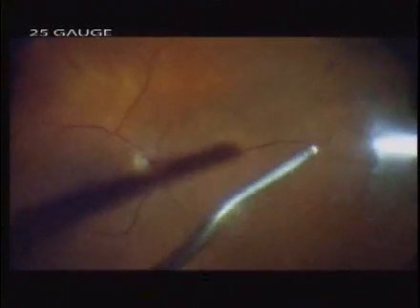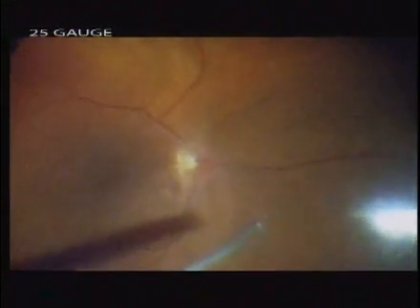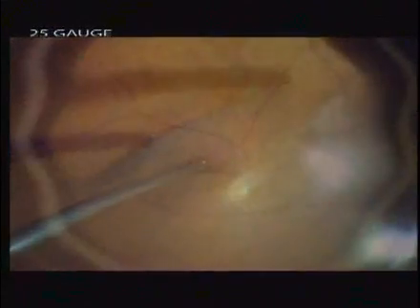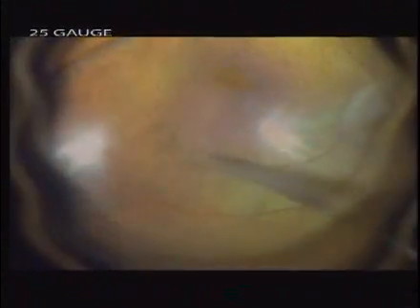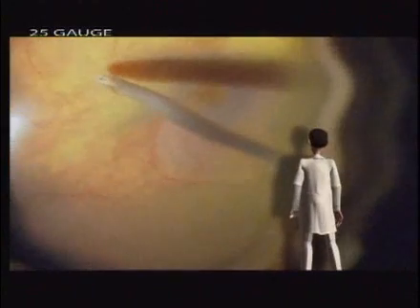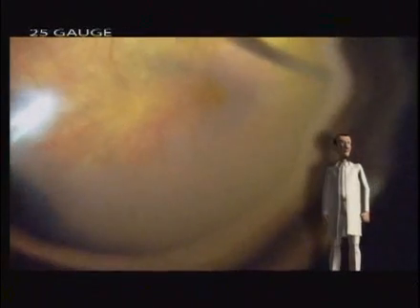The eye is moving. The vitreous cutter is moving. Everything is shaking like a belly dance. And I cannot perform a number of procedures — just the simple things. With 25G, it is difficult to remove all those membranes with small instruments. Everything is moving, and I cannot control the movements of the eye. Everything is too weak and too flexible.